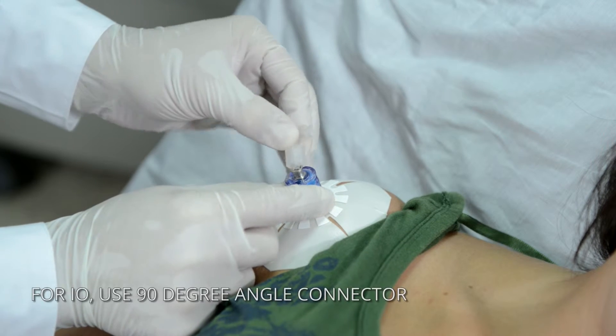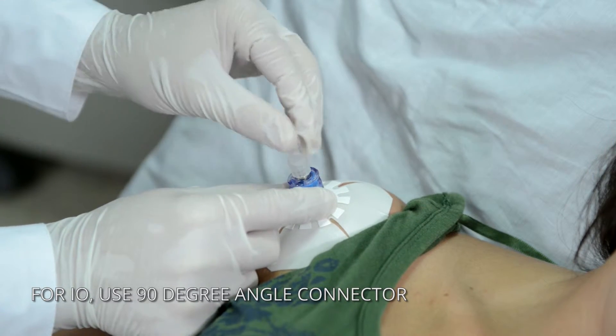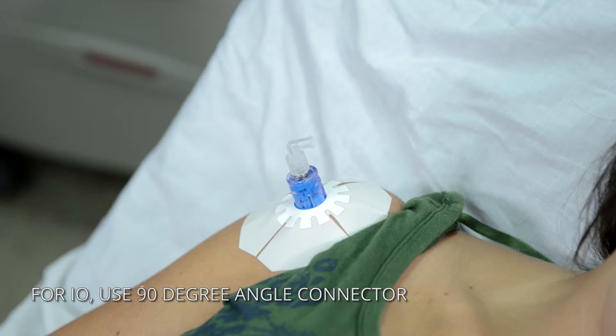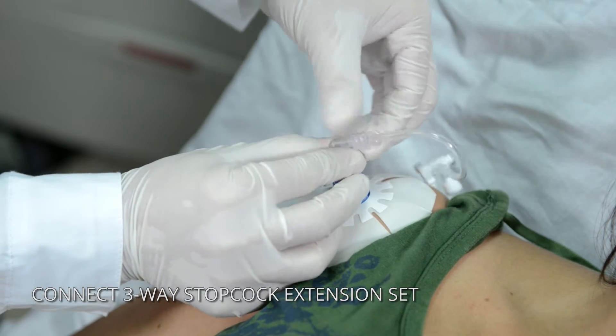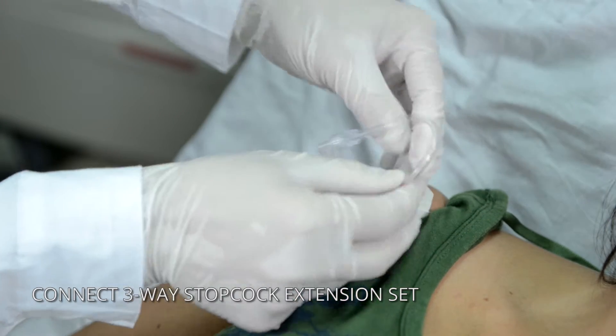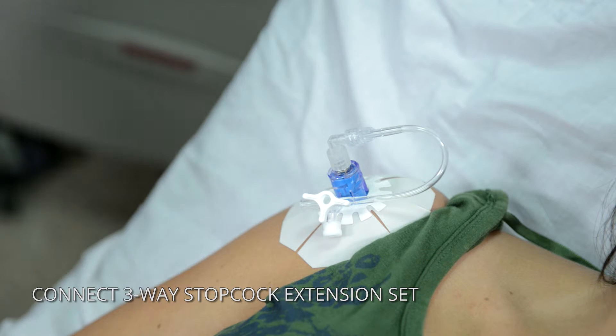The GO-IO has a unique extension set with a 90-degree angle Lorelock connector. This enables the kit to work with both I.O. and I.V. lines. The extension set consists of a three-way stopcock, which allows simultaneous administration of medications, fluids and blood products. This unique set prevents kinking of the line and allows for uninterrupted flow.